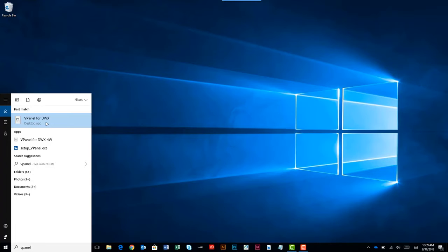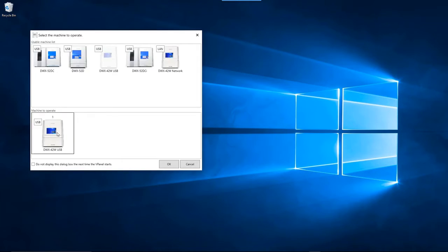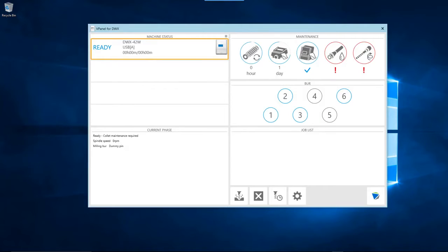Open vPanel on your computer. When the machine selection screen appears, select the DWX-42W and click the OK button. Once the vPanel home screen appears, click on the Settings button.